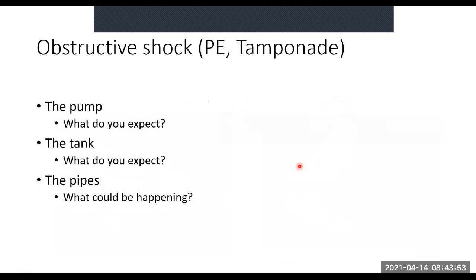Infective, TB, effusions, pericardial effusions, bacterial, viral, tumor. You can have trauma, direct bleeding, aneurysms, leak. There's a whole lot of reasons why you can get tamponade. And pulmonary embolism, normally secondary to any sort of coagulopathy, clotting disorders, DVTs, things like that, all right?